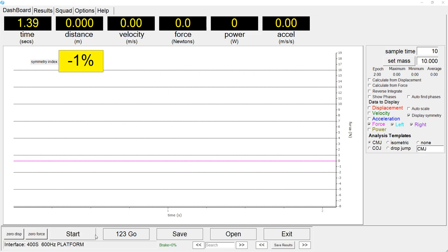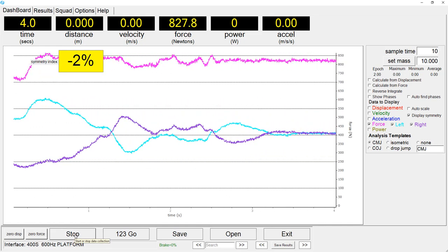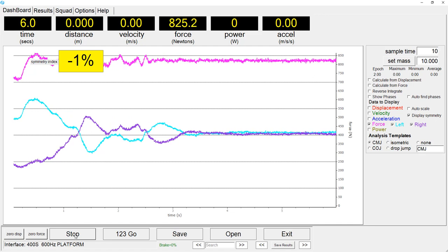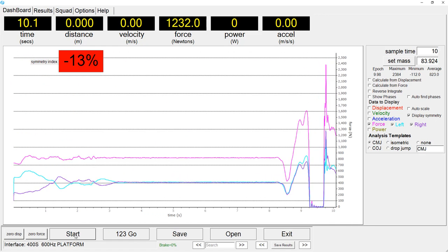We'll now perform a counter movement jump. And the athlete is positioned on the force plate. The symmetry index turning yellow indicates they are within 5% of perfect balance. They then jump and land back on the plate.